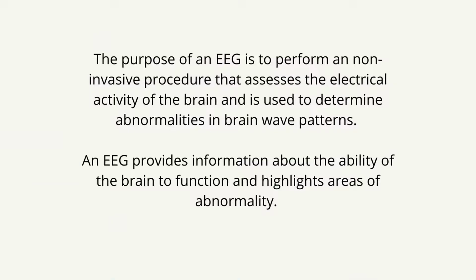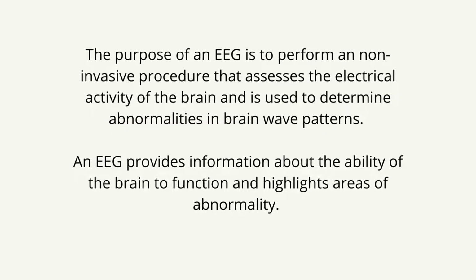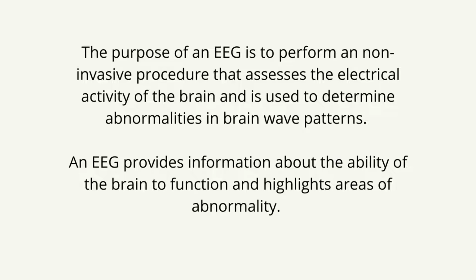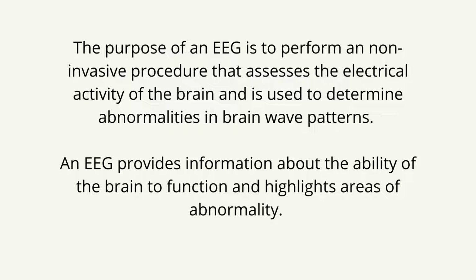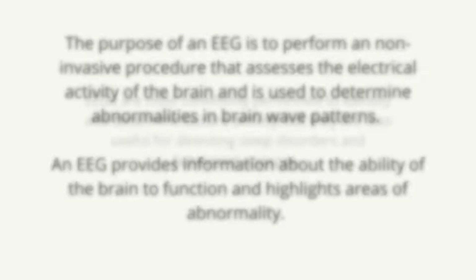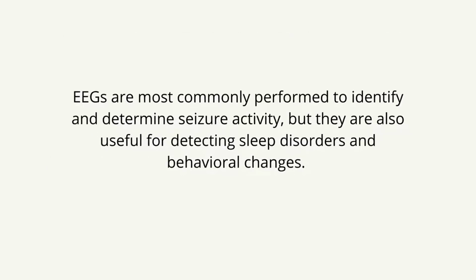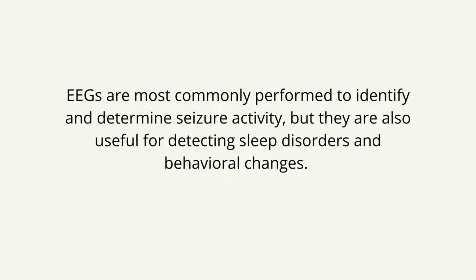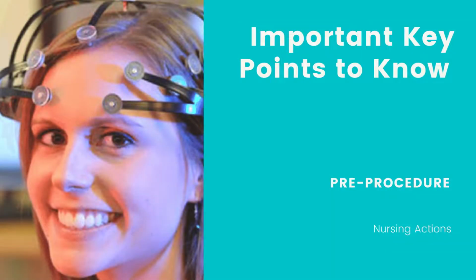Encephalography. The purpose of an EEG is to perform a non-invasive procedure that assesses the electrical activity of the brain and is used to determine abnormalities in brainwave patterns. An EEG provides information about the ability of the brain to function and highlights areas of abnormality. EEGs are most commonly performed to identify and determine seizure activity, but they are also useful for detecting sleep disorders and behavioral changes. Important key points to know.